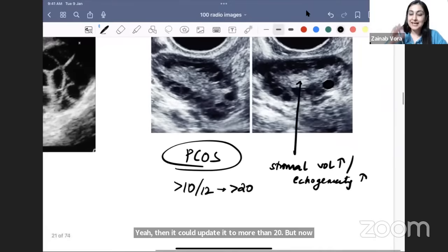At 7.5 to 8 weeks, the double bleb sign appears — you see both the amniotic sac and the yolk sac. We avoid Doppler in the first trimester because it delivers higher energy. The double bleb has been asked: what are the two blebs? One is the amniotic sac and one is the yolk sac.